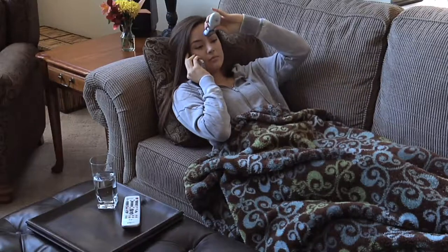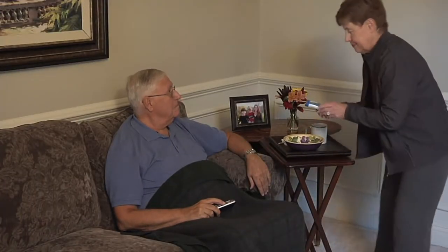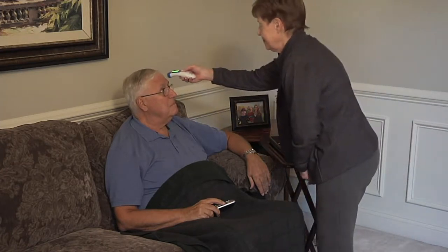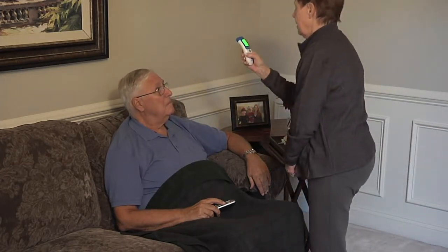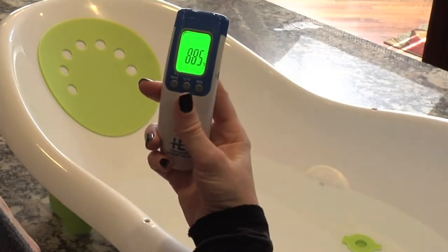You can take the temperature of someone without touching their body — not under the tongue, not under the arm, not in the bum. You actually can take the temperature of someone without touching their skin. It's easy to read because it's got color codes like a stoplight: red, green, and yellow. Super simple.